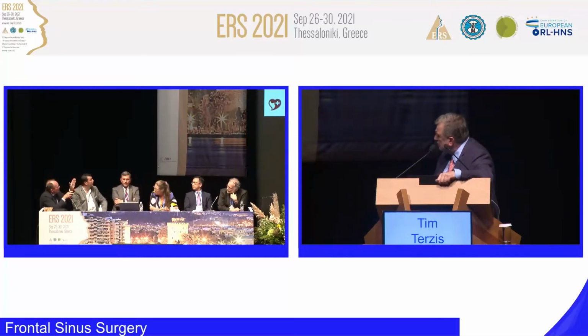So this prescribes a little bit more precisely how we access the frontal sinus. So I agree, drill out makes sense. It depends how much you remove, and then you have your grading. And this has to be documented. And I think it's of high value to speak with one language when we do surgery. Okay.